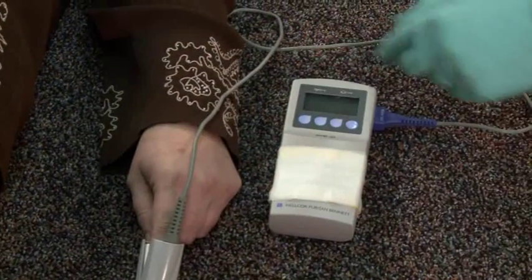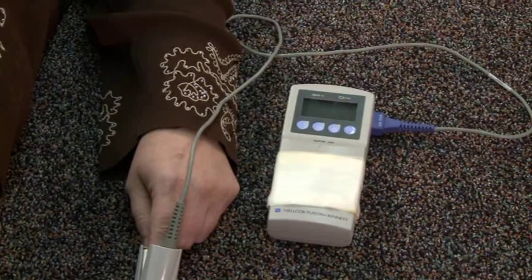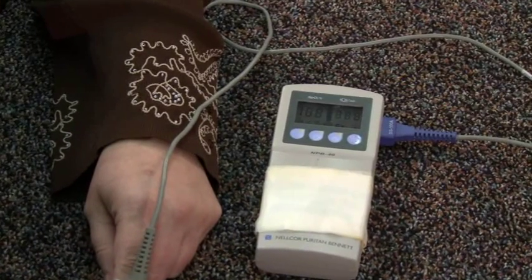Before intubation, hyperoxygenate the patient with four to six ventilations to achieve an oxygen saturation of 100%.